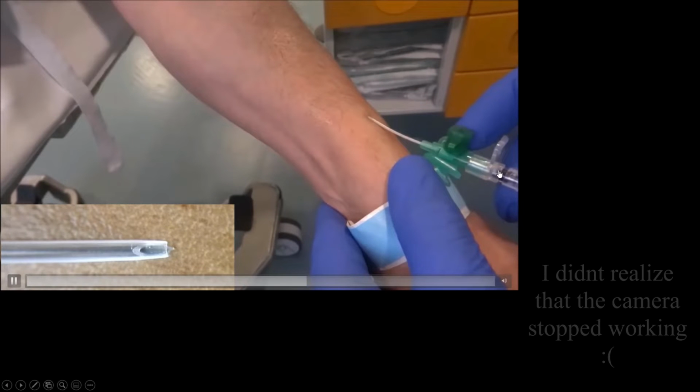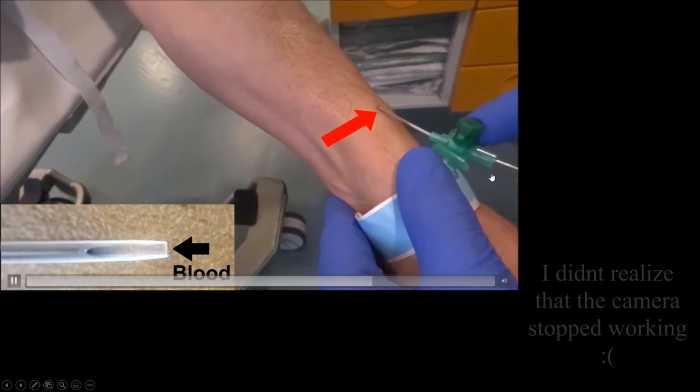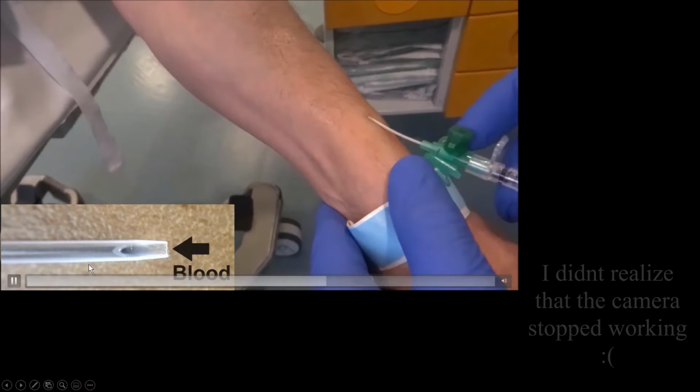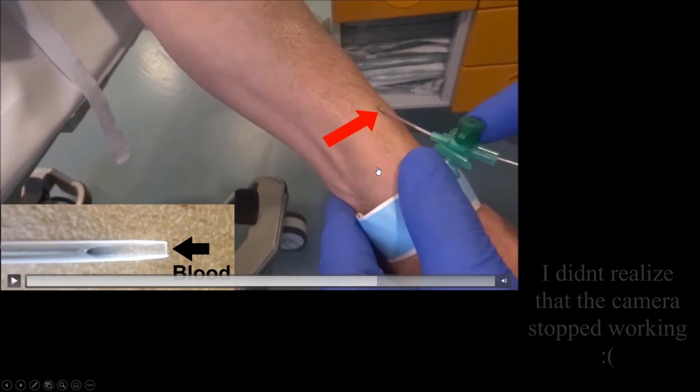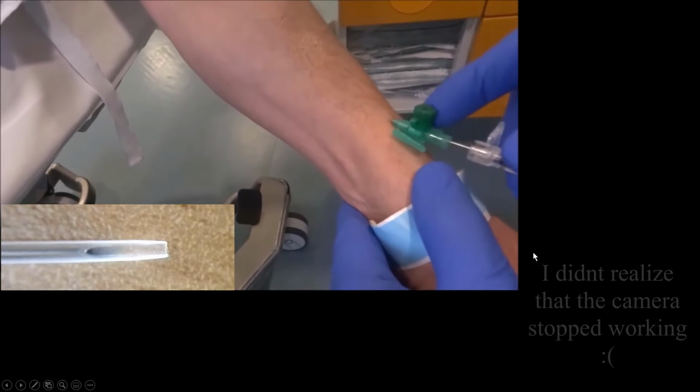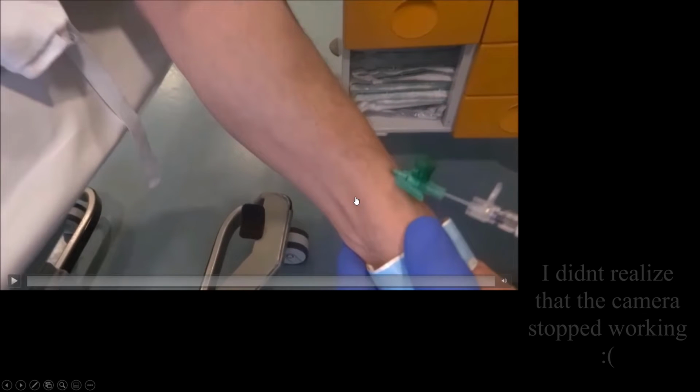Okay, so they know that they are inside the vein. Now they are going to pull back the stylet and you can see the blood coming in here. I'll repeat it. You can see the flashback chamber. Then once the stylet is pulled back, you can see the second flashback in the cannula. So we see two flashbacks while placing the IV cannula. One is in the flashback chamber, second in the IV cannula.